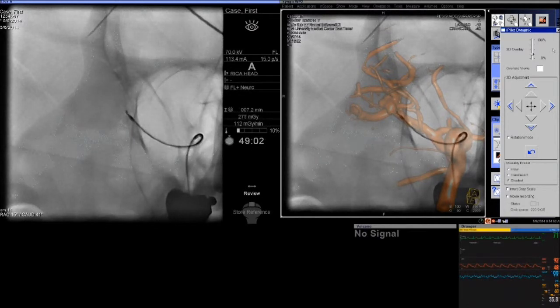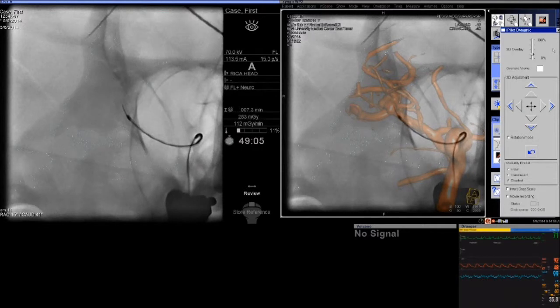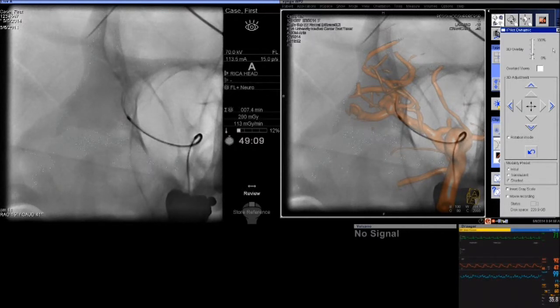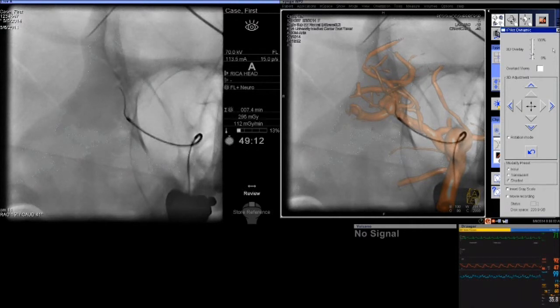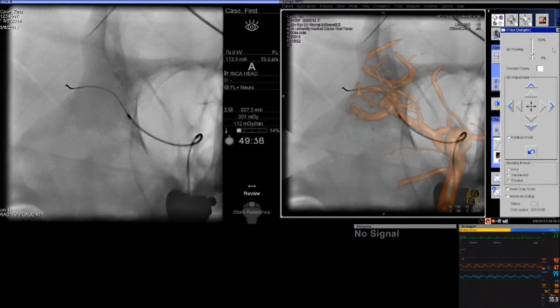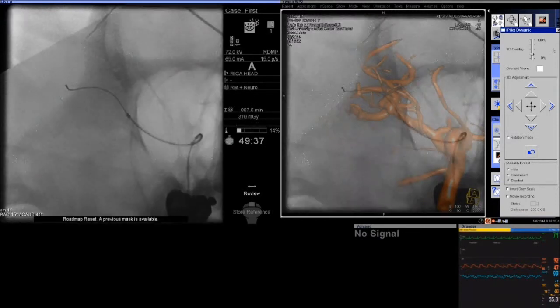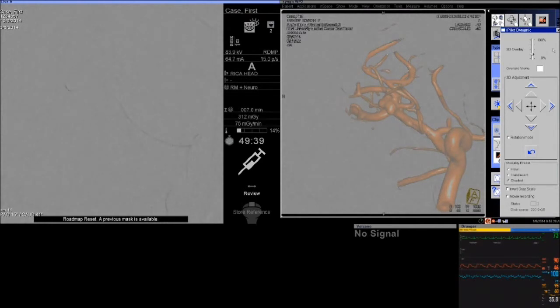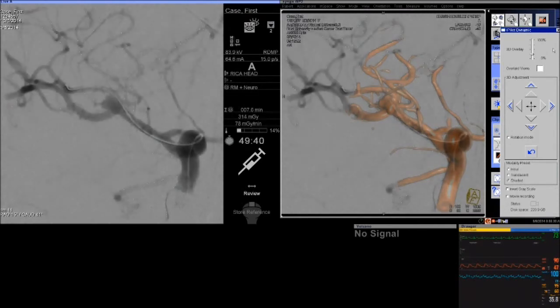On the right side, you can choose the angle of the anatomy without having to do constant new roadmaps as you're trying to navigate this very challenging anatomy. Many times you may have to change the position of your tube as you move into this anatomy, so having the 3D roadmap gives you a lot of flexibility.